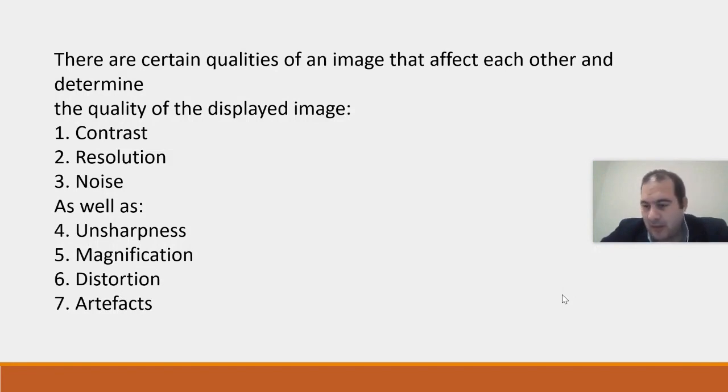And in fact, there is a part that relies on the radiologist to produce an excellent report for the image. The assessment of image quality includes a quantitative assessment, which is somewhat related to the medical physicist who performs calculations to determine whether the image quality is optimum or not. There is also a visual assessment, which is a subjective analysis that heavily relies on the radiologist, who can determine whether the image is correct or incorrect. Additionally, the visual assessment is largely dependent on the radiologist.